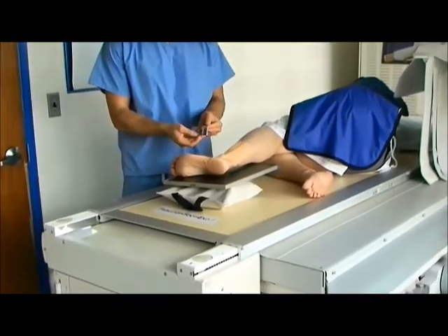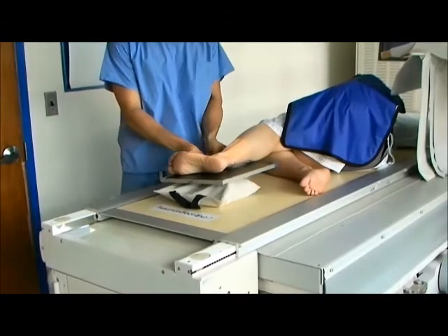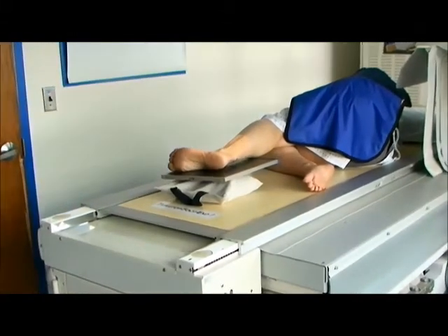Collimate as needed and be sure to place the marker anterior to the anatomy.